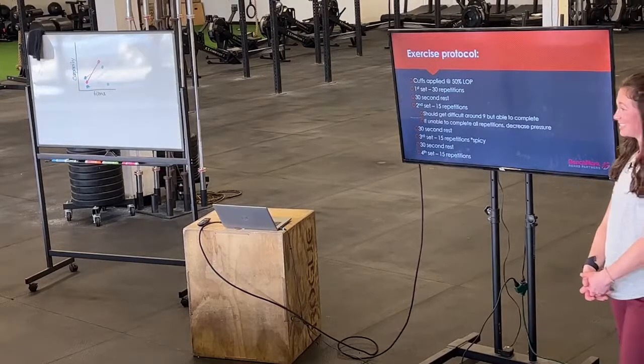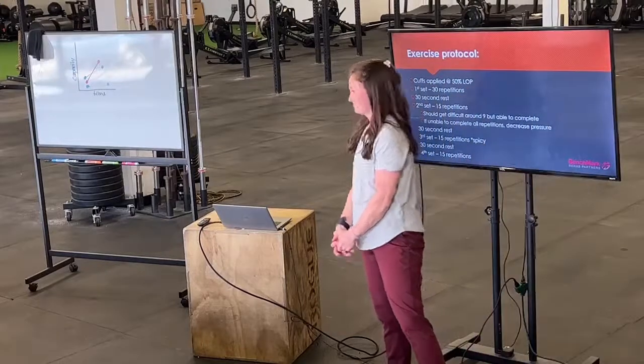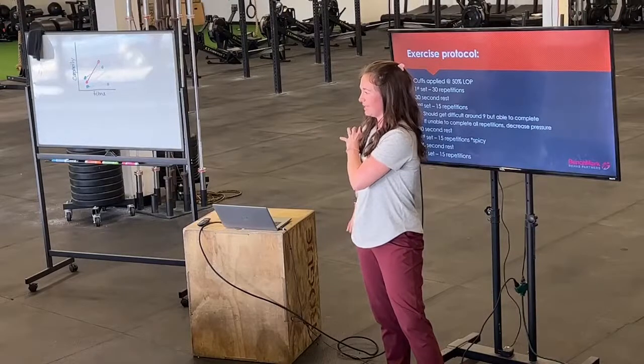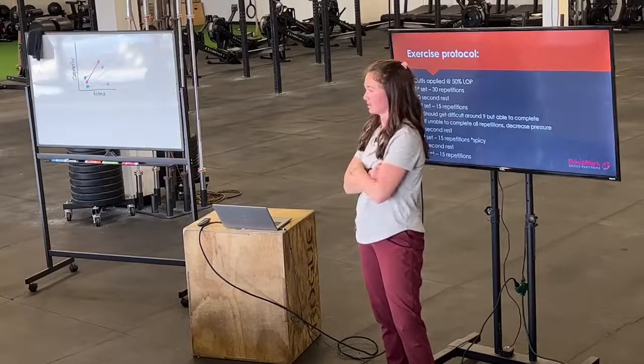Is the tourniquet always to be applied high on the extremities? So even if it's an ankle, it'll be applied high? Yes. There's only 2 places that we apply it. So here and here. And that way you can work anything distal to the application of the tourniquet.